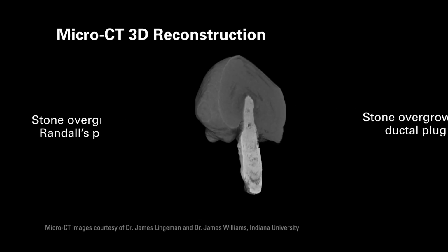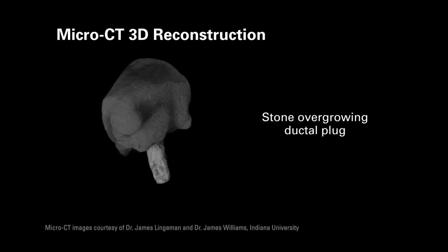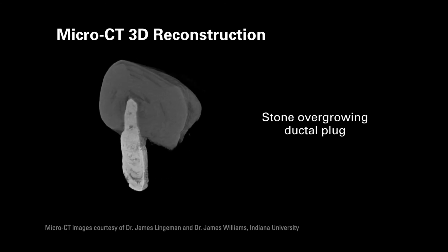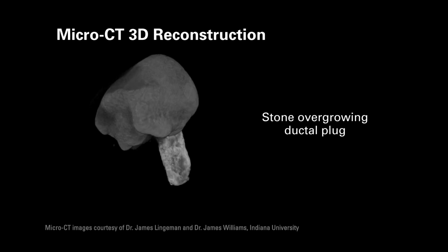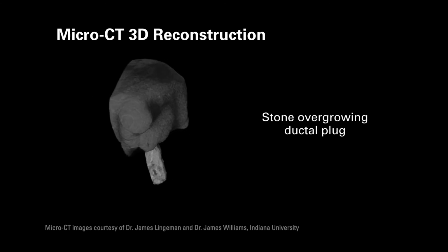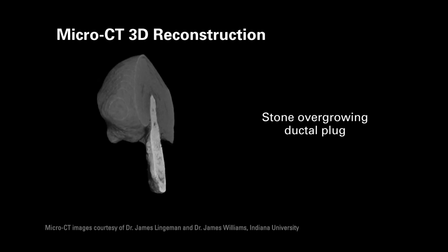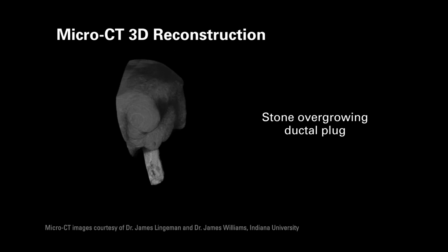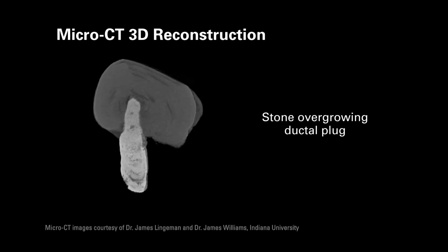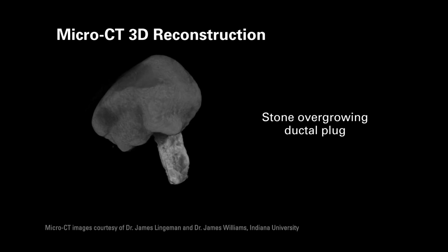If you look inside a lot of kidneys, you often see mineral under the urothelium that's more yellowish colored. It tends to be more concrete, like full deposits of mineral, and we call these ductal plugs. And if you biopsy them, unlike plaque, which has kind of a thin layered structure, plugs can be big concretions of mineral that extend deep into the tissue. And we also have research to support the fact that this is a different mechanism that stones can grow from.